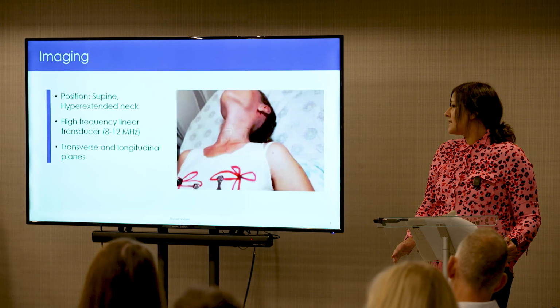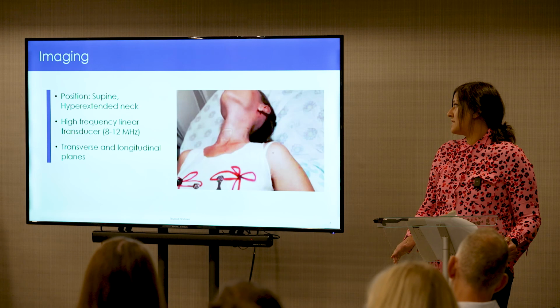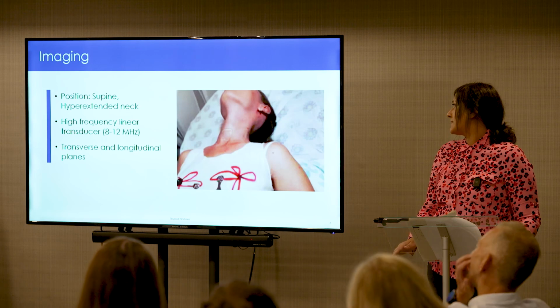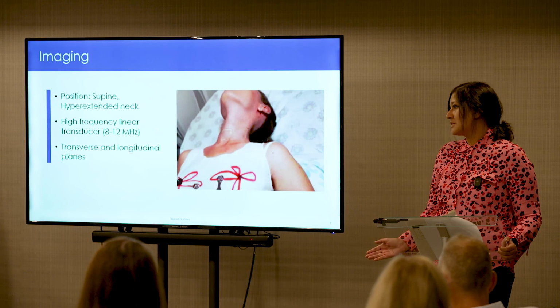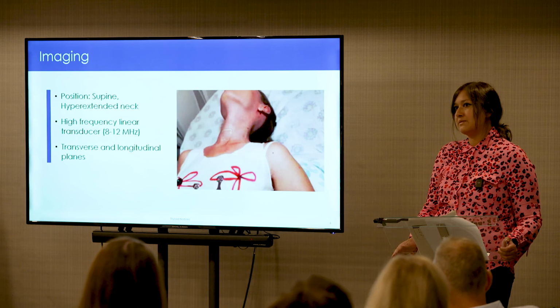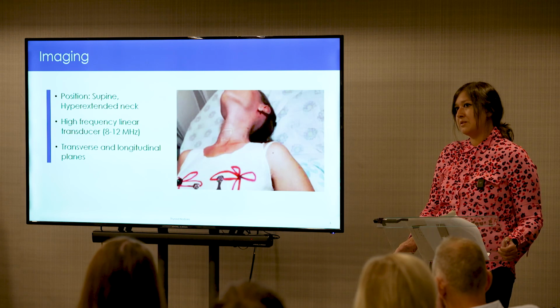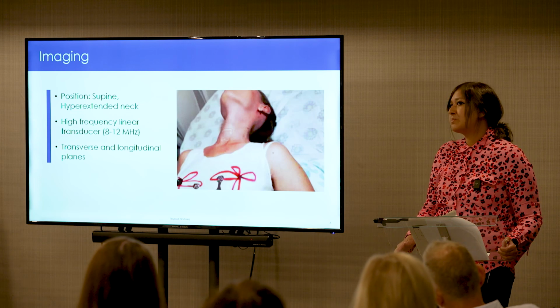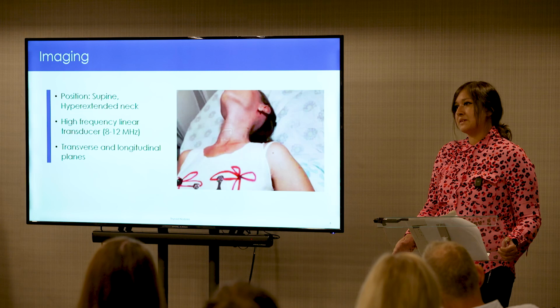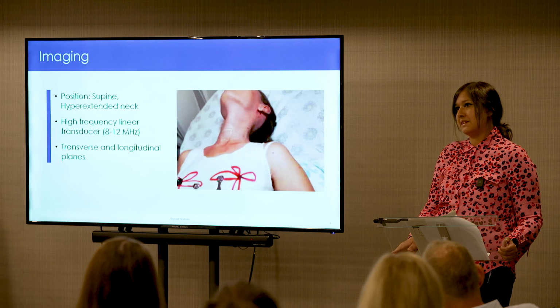This has already been covered by Fiona and Michael, so I'm just going to quickly whiz through this slide. I tend to have my patients lying flat, although 45 degrees is absolutely fine. I want to make sure the patient is comfortable, so it's completely dependent on their comorbidities and how well they can tolerate this. I like to have the neck hyperextended as well, as it opens up the field of view and allows you to get better pictures. It also allows better surface contact with the skin.